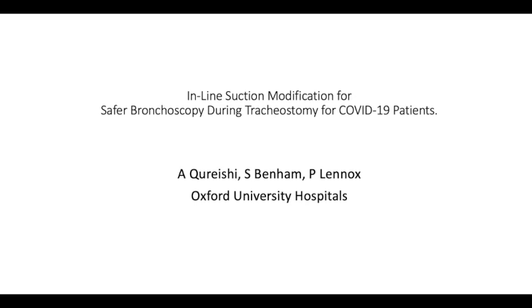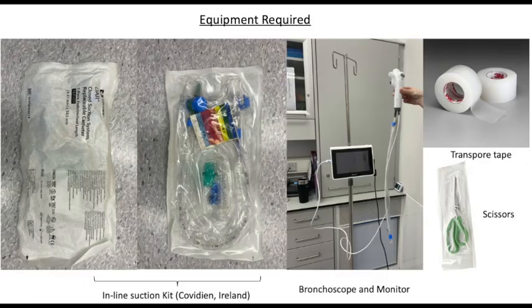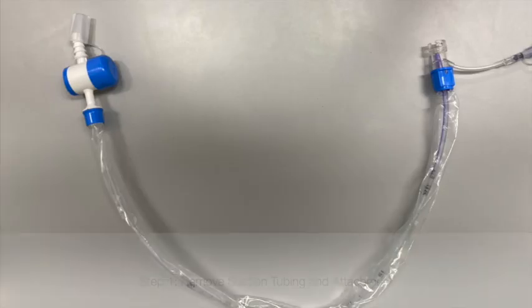This video demonstrates a step-by-step process whereby a closed suction system can be modified to allow for safe bronchoscopy during tracheostomies in coronavirus patients.